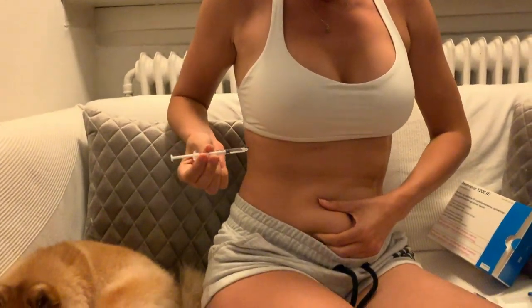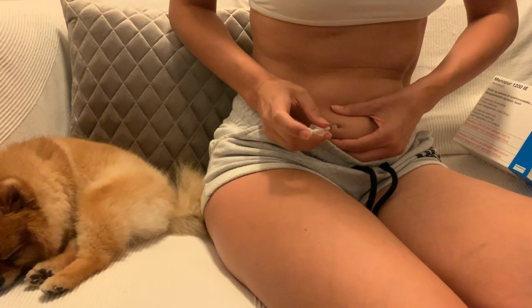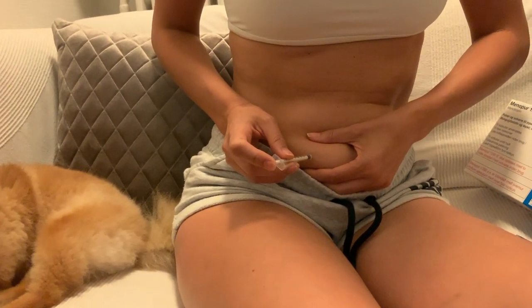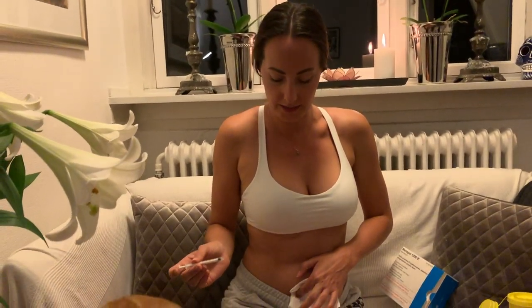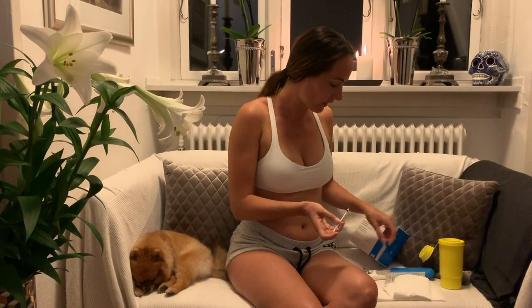When you're doing it yourself, it's easier to just do it in the flesh here — you can grab it like this, just hold it, insert the needle at 90 degrees, and just slowly inject the fluid. Then take it out and use a little bit of paper or something to hold it right after the injection — just compress it for a few seconds. Then you can just rub it a little bit to make sure the fluid doesn't stay in one place — very gentle — then find the cap again and put it back on.